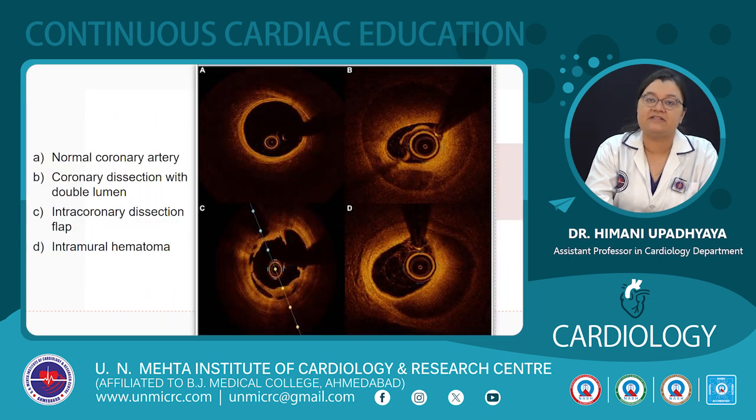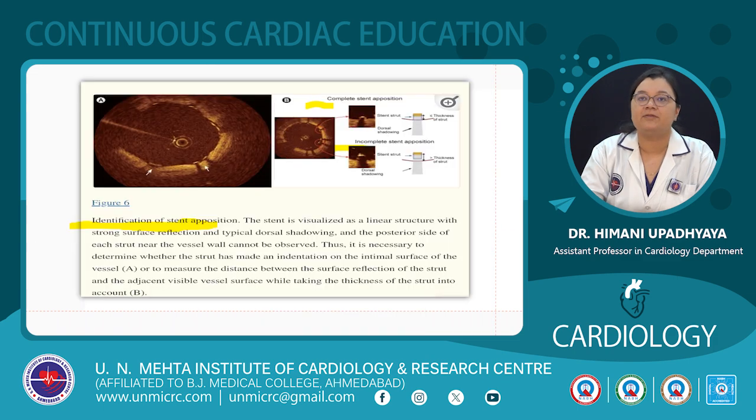So these are the images. The first one is showing a normal coronary artery. The second is coronary dissection with true and false lumen. The third is an intracoronary dissection flap. And the fourth one is intramural hematoma. The intracoronary dissection flap and intramural hematoma should be further treated with a stent. In case of IMH, we can also use a cutting balloon for stent apposition, as we can see in image B.